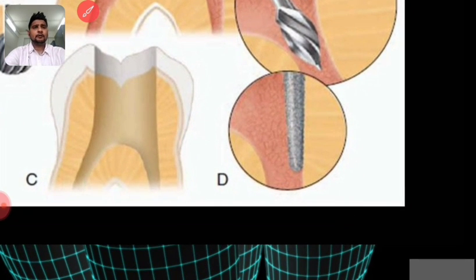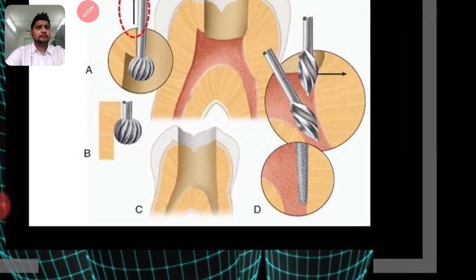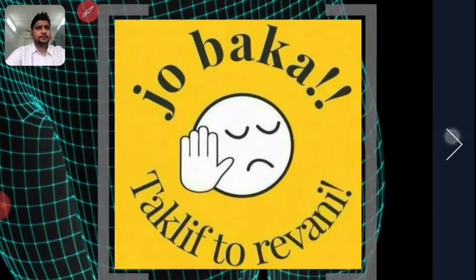All right, or any rotary orifice opener like ProTaper has an SX, the 8% in twisted files, or Hero Shaper orifice opener. I enjoy any of them. I would go for 8% twisted from Kavo because it's quite flexible. So you can do the orifice opening with that.